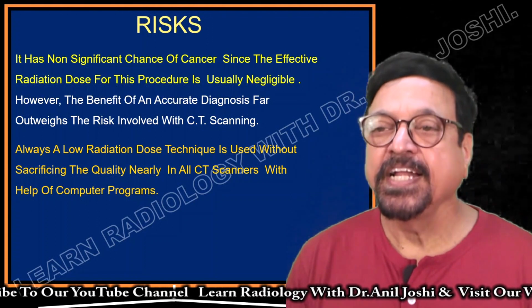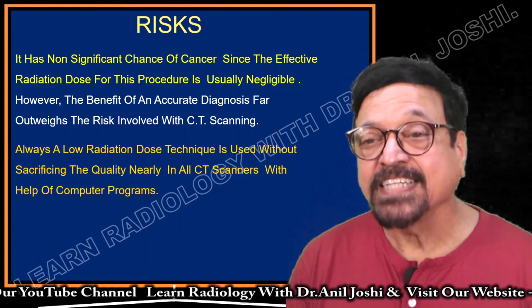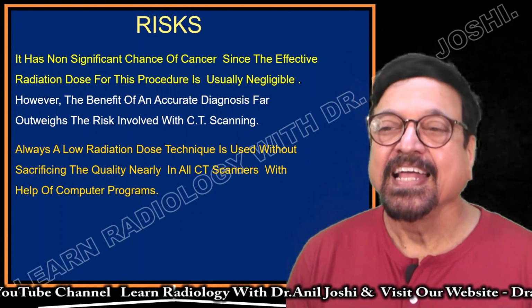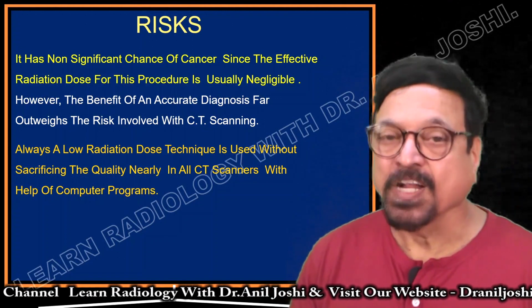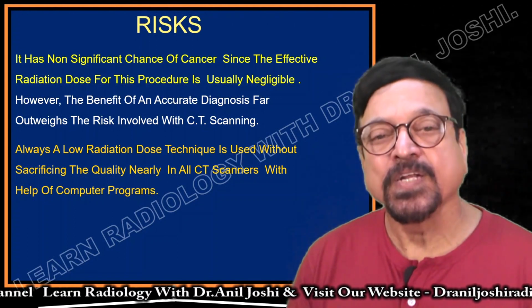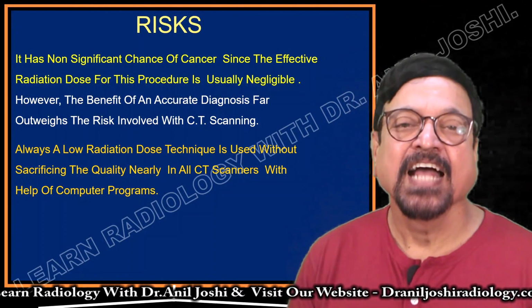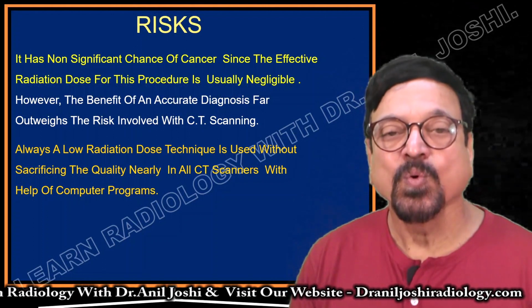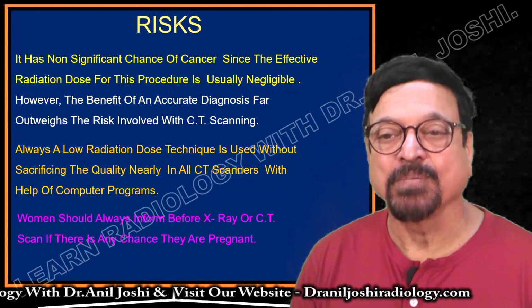Always a low radiation dose technique is used, not sacrificing the quality, in all CT scanners by the manufacturers with the help of computer programming. So this is a low radiation technique used by all manufacturers, so that, as far as possible, to achieve the best results, the radiation dose is adjusted by the computer.